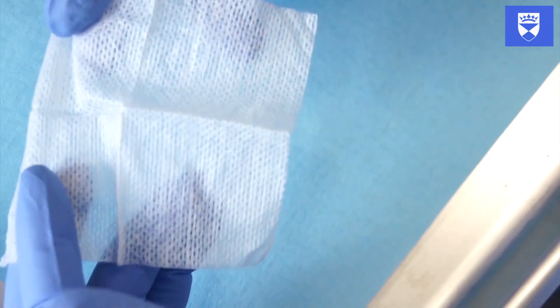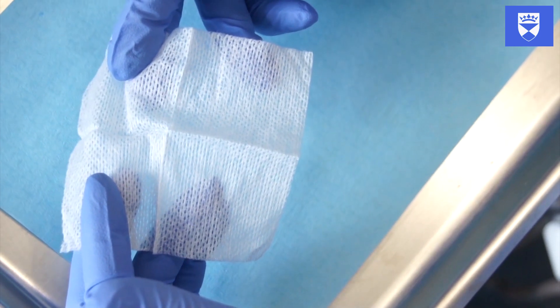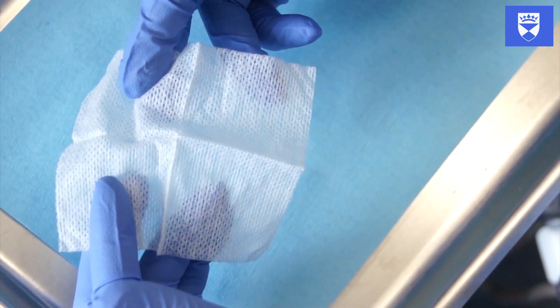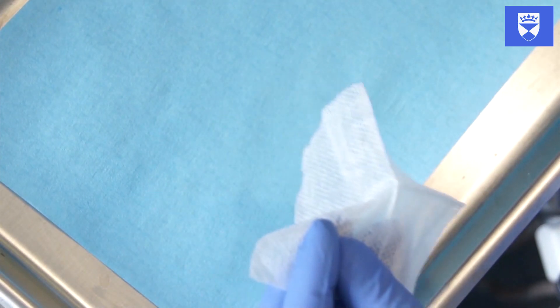Once you are happy with your crown selection, it is time to try the selected crown over the tooth. For this, the patient should be semi-recumbent or upright. It is imperative that the airway is protected to prevent aspiration of the crown. There are many methods to do this.